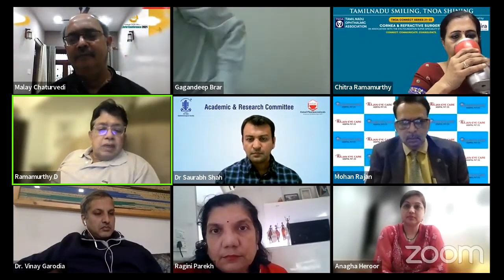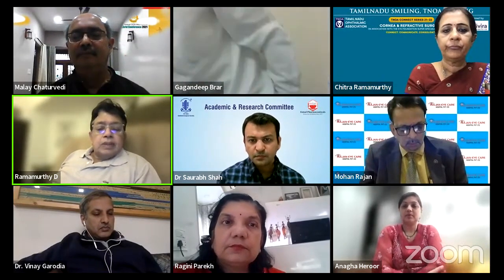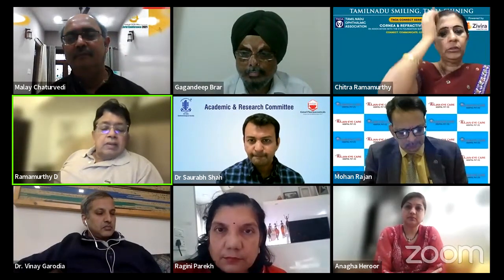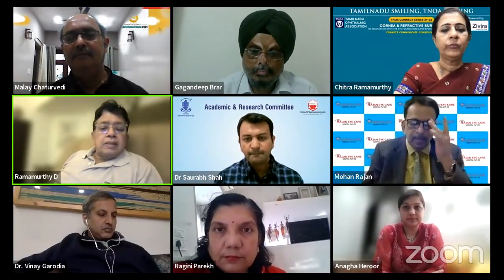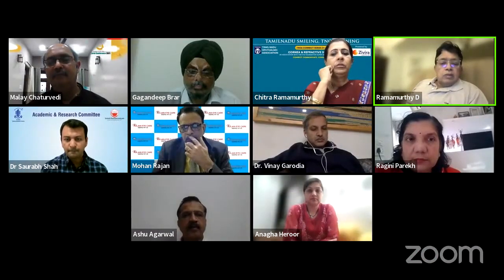And all points very nicely emphasized, Dr. Saurabh, but maybe we just mentioned it in passing. One of the things in these high myopes that I always do is to keep the IOP extremely low. I mean, this is one situation where I keep it at 20, which takes a bottle height of about 31 centimeters. So if your machine doesn't have the ability to fix the IOP, reduce the bottle height to a minimal amount. And that gives much better control of most of these deepening of the anterior chamber, whether it's during the phaco steps or during IA.